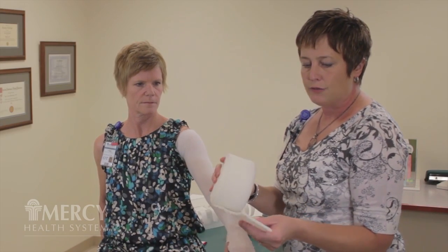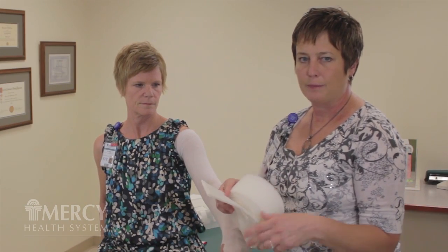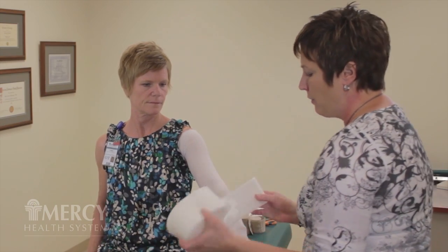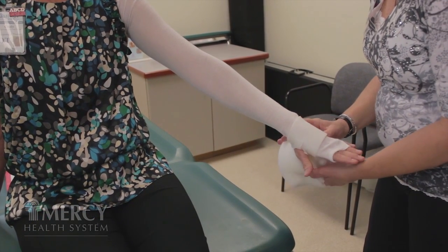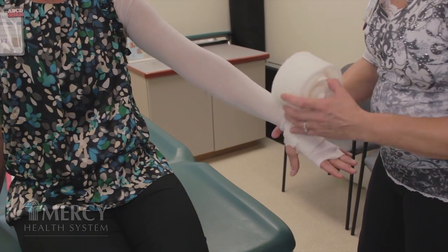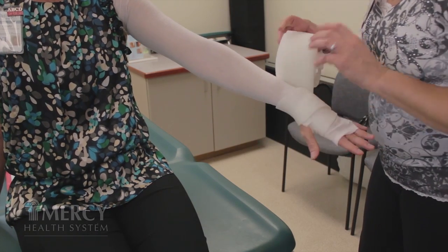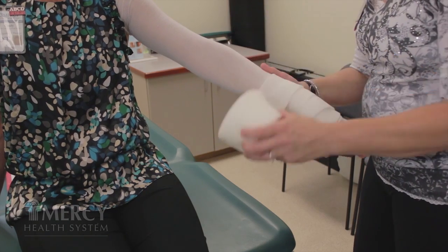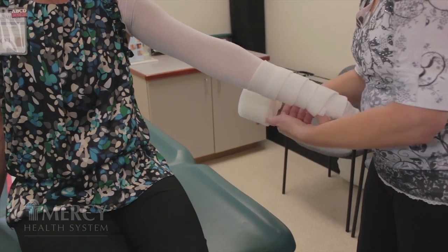The foam band has some stretch to it, and we protect the ends of that foam with a little bit of tape because it's very easy to tear. There's a thumb hole placed here for Cindy. I'm going to start on the small finger side of her hand, hold it down there with one hand as I bring that roll around, secure that end underneath my roll, and continue up the arm. As I'm wrapping the foam, I'm overlapping it halfway over the previous layer and giving it a little bit of tension to help take up the slack.